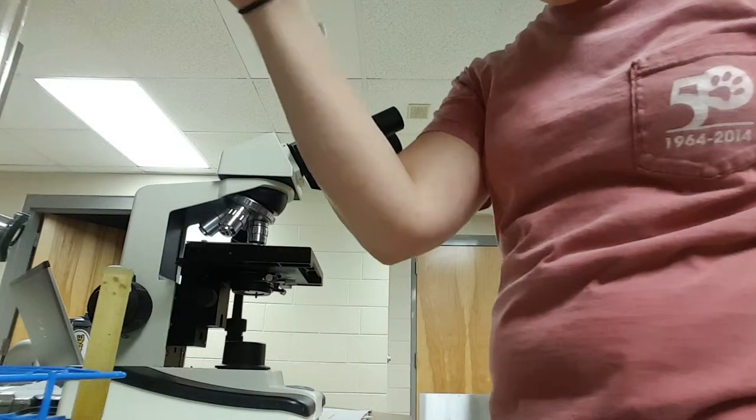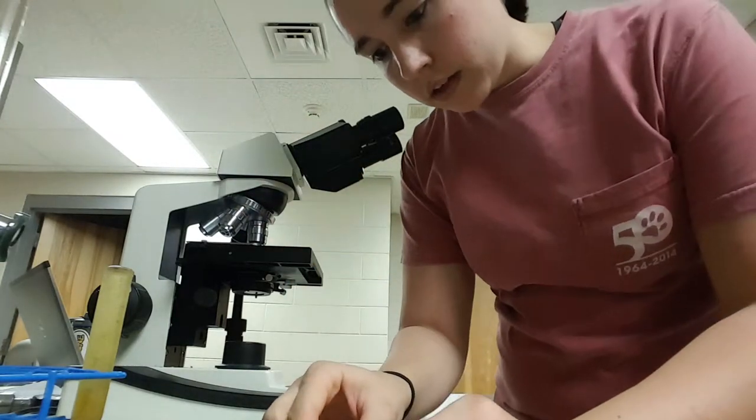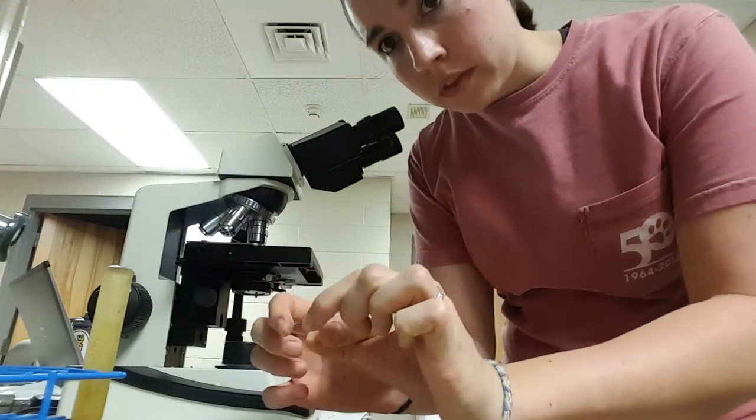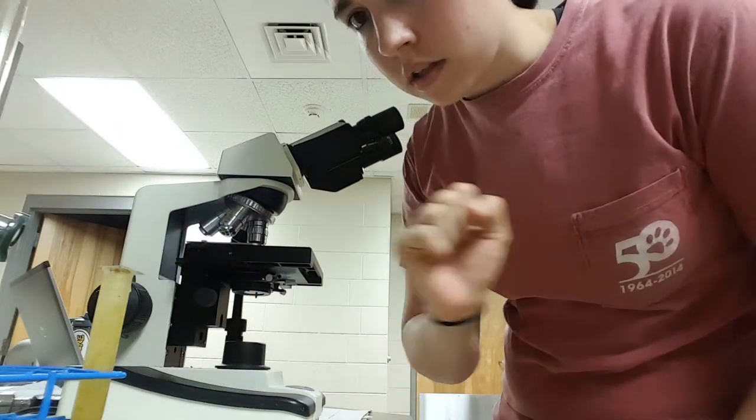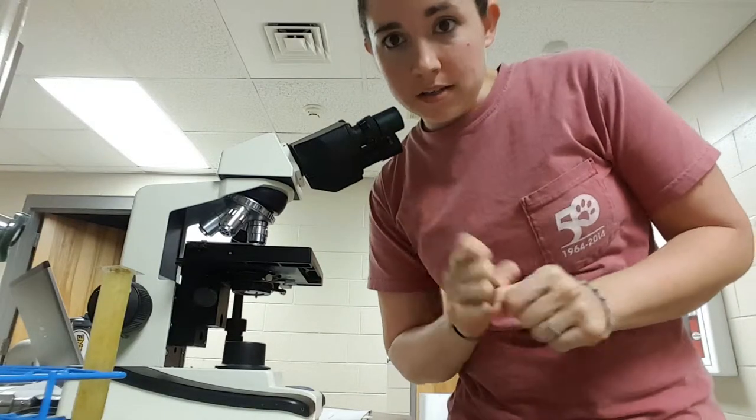I have a cover slip here and I'm going to place it on top of the meniscus like that. We need to let that sit for 10-15 minutes for the test to set up thoroughly, so I'll be back in 10-15 minutes.